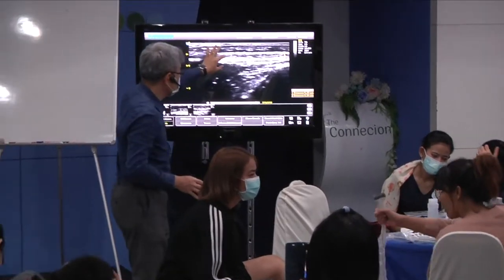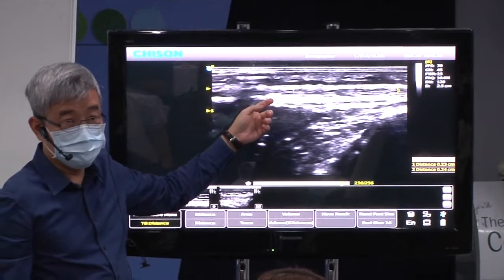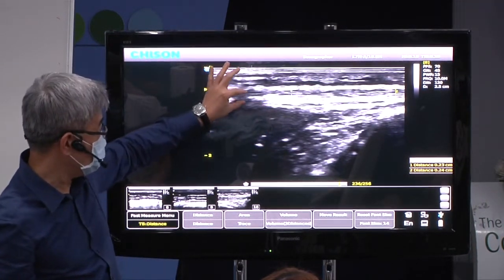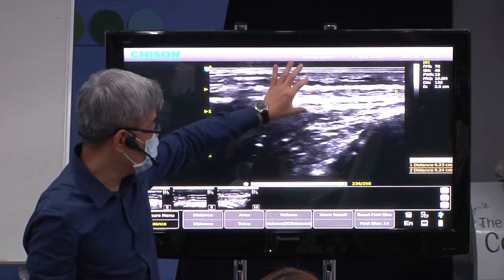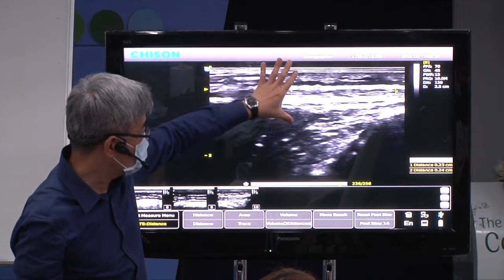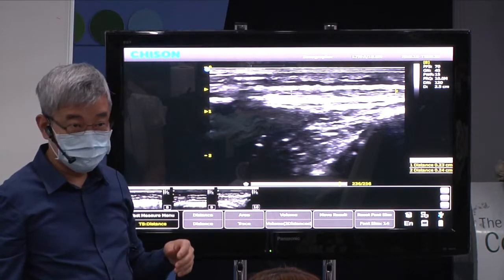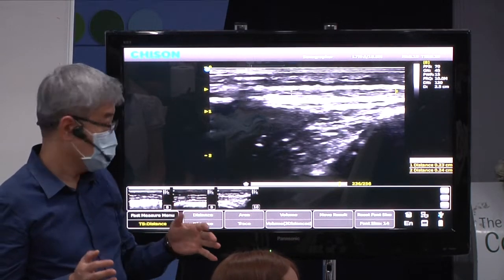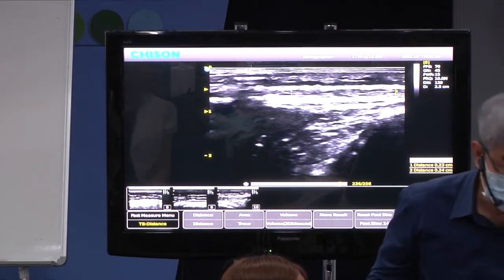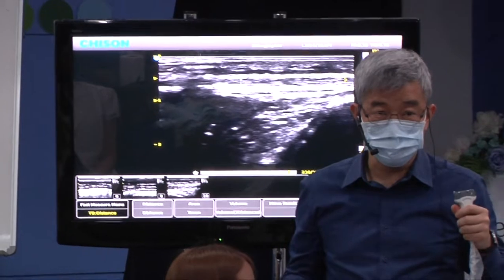The thickness of the tendon is very important when you check the morphology. If there is a focal thickening, we call it spindle-like thickening. That is a sign of tendinosis, focal swelling. So you need to use your device to do some measurement later.